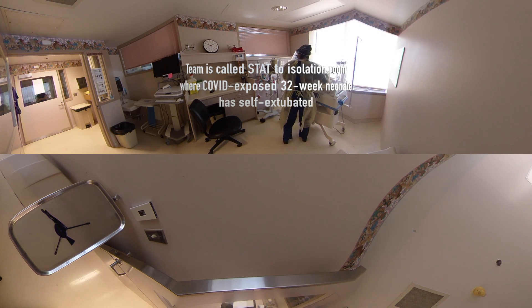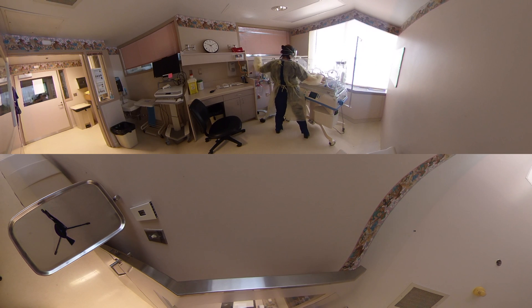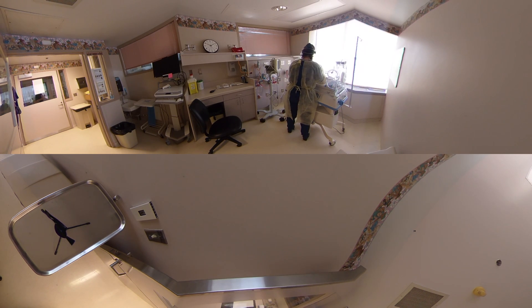Oh, baby's deciding — heart rate is down, I think the baby self-extubated. Can I help you? Yeah, I need a team, I think the baby self-extubated.